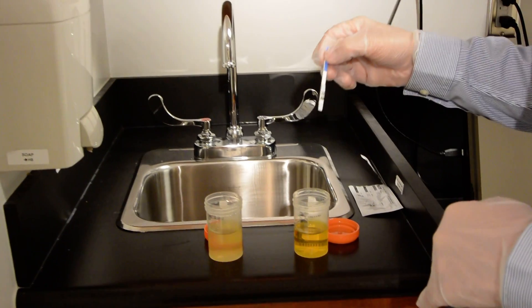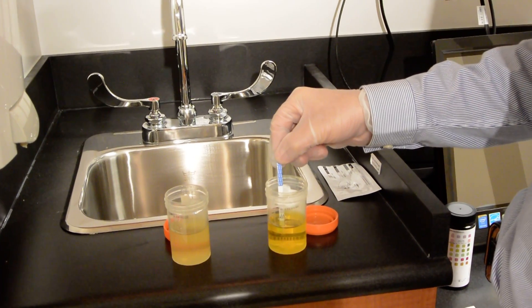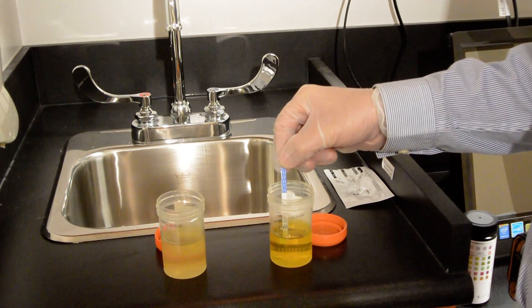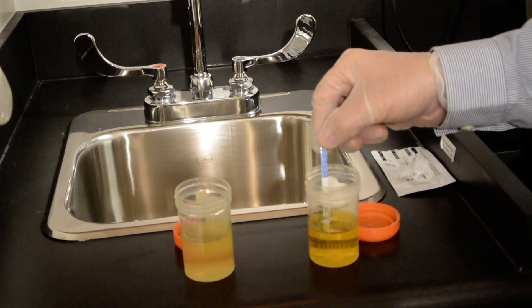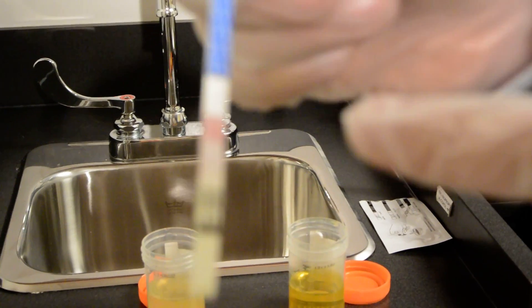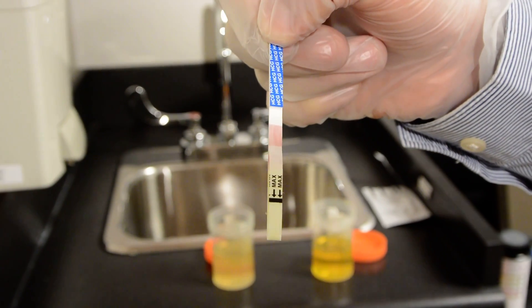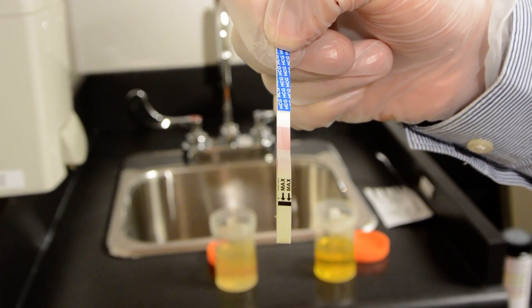So you take the stick and you put it inside the container, making sure not to go over the max line and you let the urine diffuse into the stick. As soon as you see color coming up then you can take it out of the urine sample and you wait.